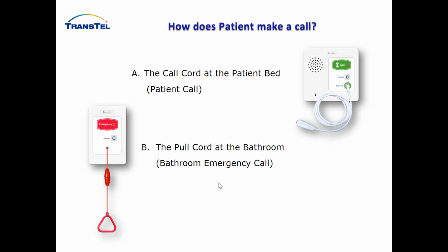How does the patient make a call? They can use the pull call, this talking device, or they can use the pull call in the bathroom. You see, this is a special design. It means that when the pulling force goes over a certain force, this will break. Of course, after that you can attach it together again, but it is a safety feature.